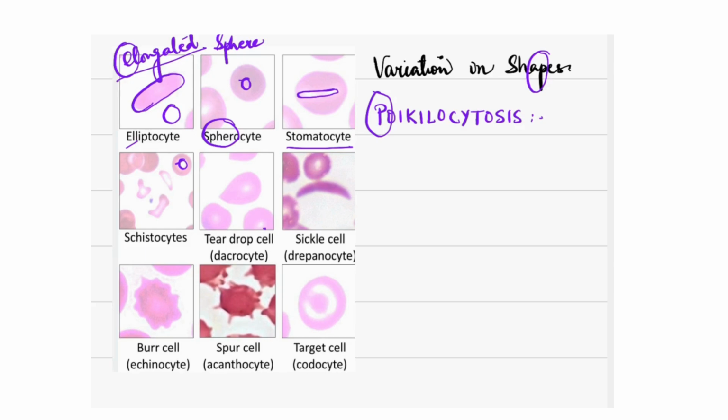All right. Now schistocyte. A schistocyte is like something which was traumatized. The shape is distorted because it was traumatized. Just imagine there's a pipe with a lot of spikes, and something very soft like RBCs passing through that pipe. Okay. Now what will happen to those red blood cells? Their shape will be mutilated. There will be a lot of destruction of RBCs. Correct? So this fragmentation, destruction, mutilation of RBCs, this shape, what we get is schistocytes.